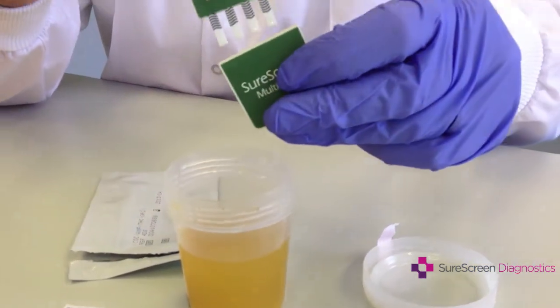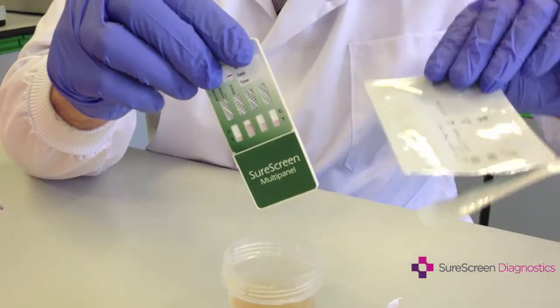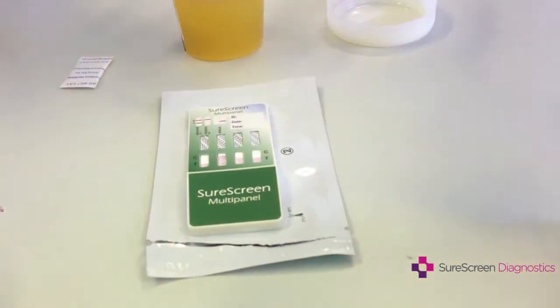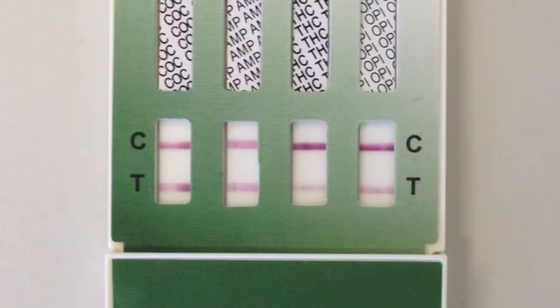Put the cap back on and place it on the work surface to develop. Start a timer and read the test in 5 minutes.